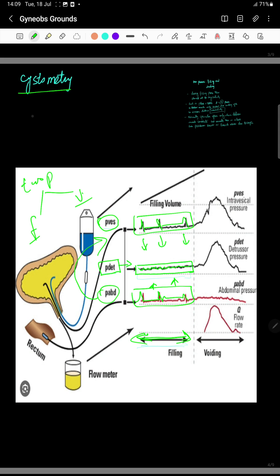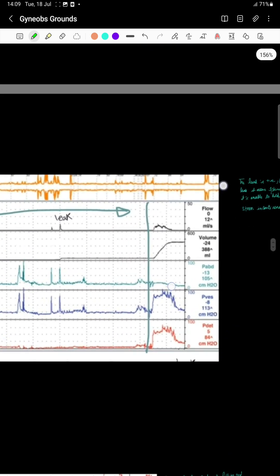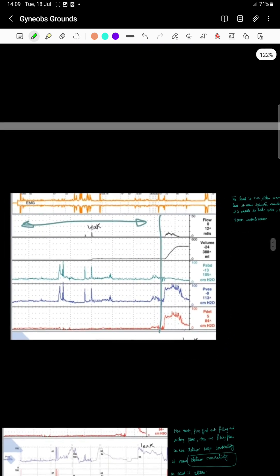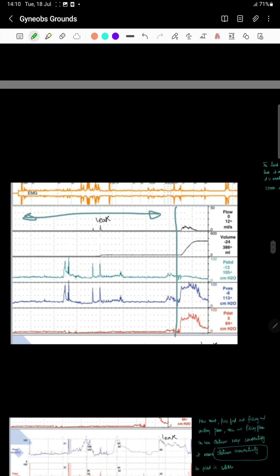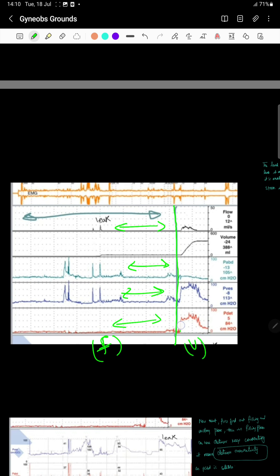Now let's move to the next graph. This is our second graph. Here you see the filling phase, the abdominal pressure, the vesical pressure, and the detrusor pressure. Remember to first identify the filling phase versus the voiding phase. This is the voiding phase where the detrusor activity is positive and voiding occurs.